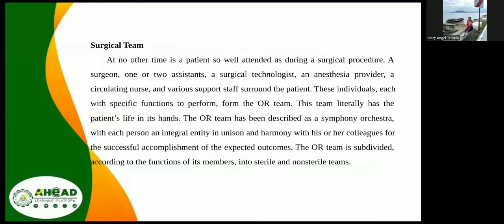Surgical team. At no other time is a patient so well attended as during a surgical procedure. A surgeon, one or two assistants, a surgical technologist, an anesthesia provider, a circulating nurse, and various support staff surround the patient. These individuals, each with a specific function to perform, form the OR team. This team literally has the patient's life in its hands.